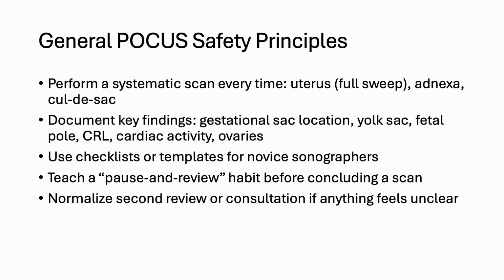So just a review of general safety principles. It's important to perform a systematic scan every time. I always do my AFIs a certain way because that way I won't forget one. It's easy to get talking to the patient. It's easy to get distracted. Somebody comes in and asks you a question. The baby moves and you think it's cute and you want to get a picture. So I always do my AFIs a certain way. I always put the ultrasound on the patient a certain way, and I have a routine of how I do things, and I always look for the heartbeat first.